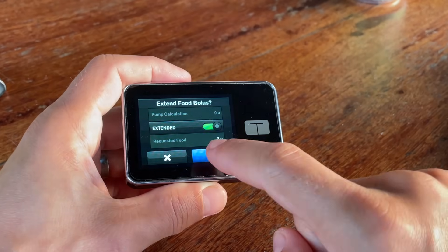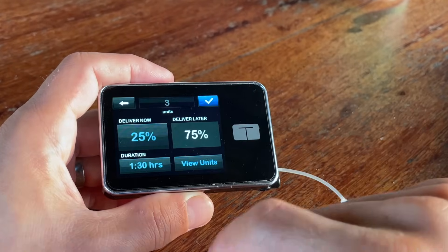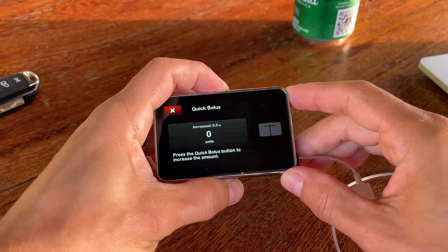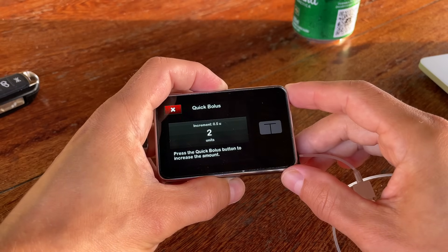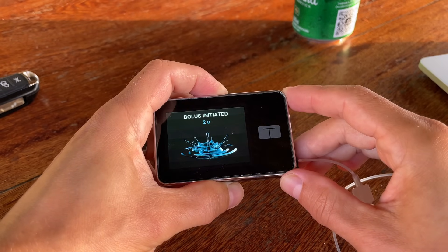On the other hand I quite like the extended bolus feature, because you can tell the pump what percentage of the bolus to deliver right away and what percentage to deliver over a defined period of time. There's also a quick bolus option where you can initiate a bolus without looking at your pump using just the top button, though you can't use the carb calculator or the extended bolus function with it.